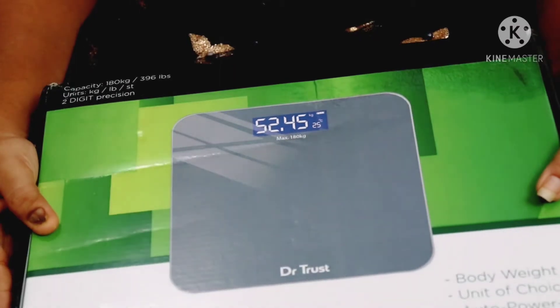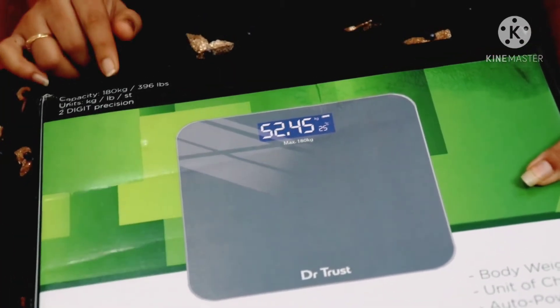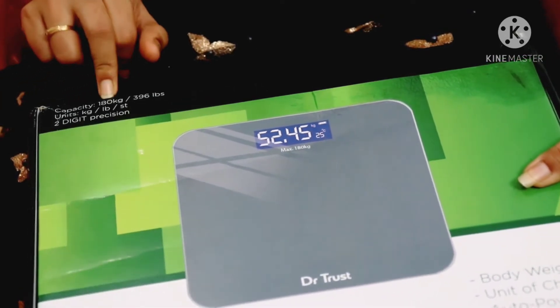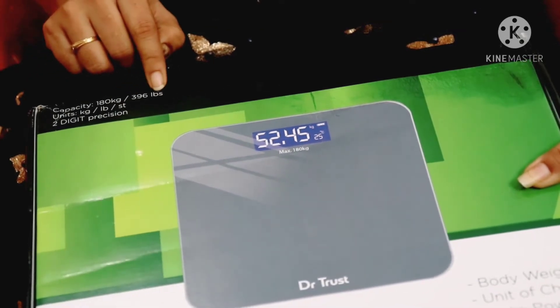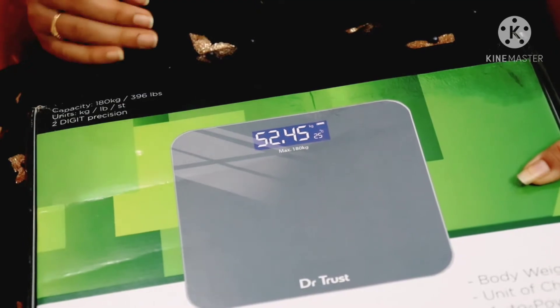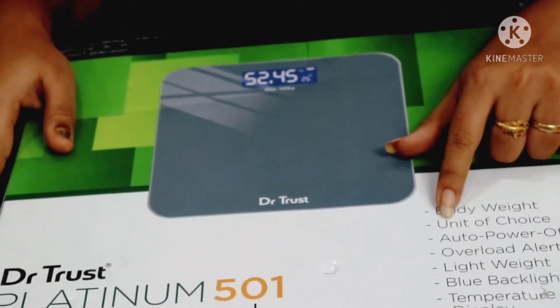I'm going to show you some highlights. It's 180 kg and 396 lbs. I'll show you body weight and a unit of choice.